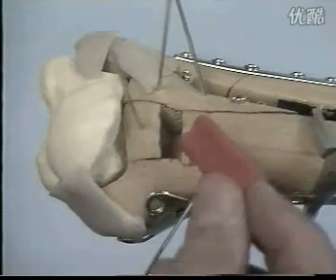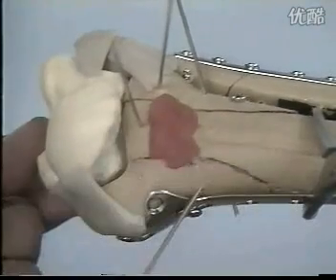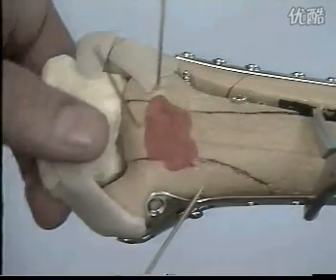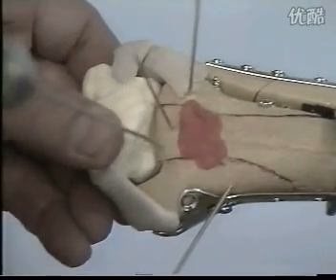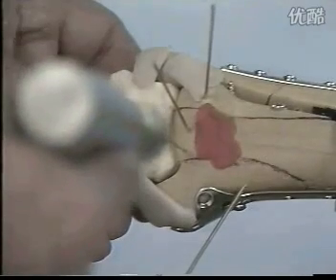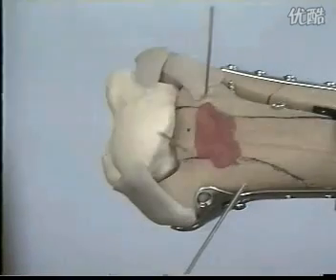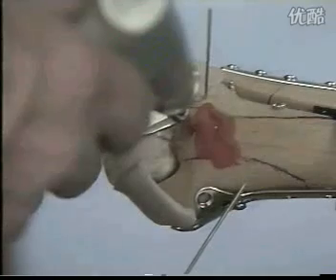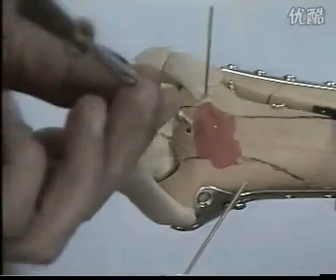Finally, we fill the metaphyseal bone defect with previously extracted cancellous bone. The place where we inserted the preliminary K-wire into the central fragment is identical to the position planned for the screw insertion. Therefore, we will temporarily insert another wire and replace the first one by a cancellous bone screw. A washer prevents the screw head from sinking into the bone.